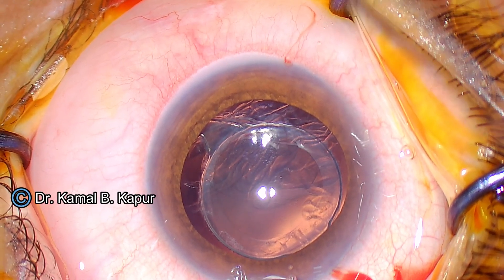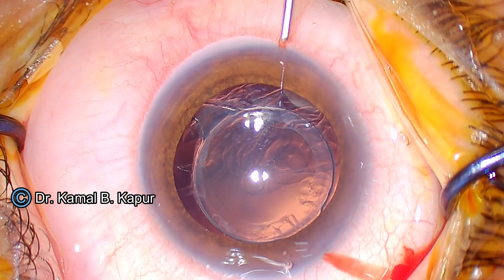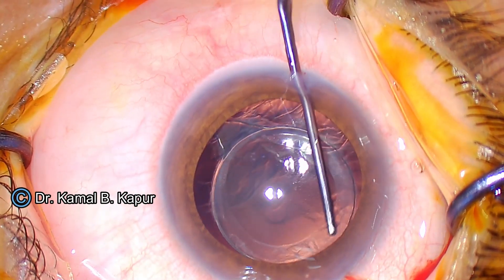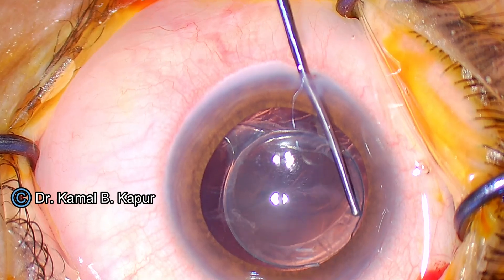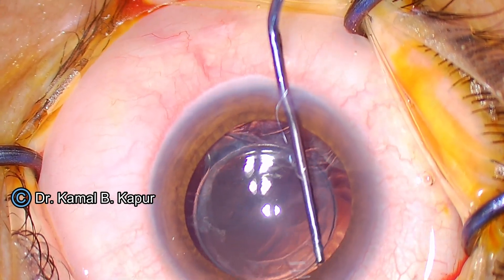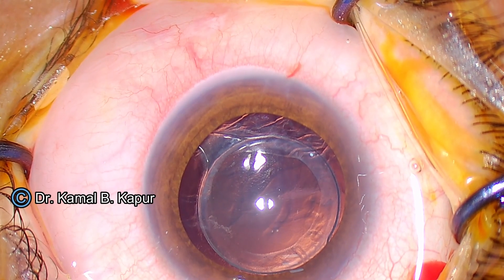I have proceeded by making two side ports and installed viscoelastic in the center. Now we start by actually differentiating and separating the anterior part of the capsule overlap over the IOL first, because if you do not do this, the whole capsule or bag can be compromised.